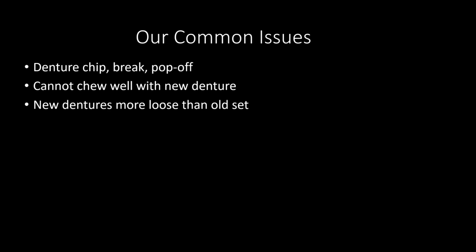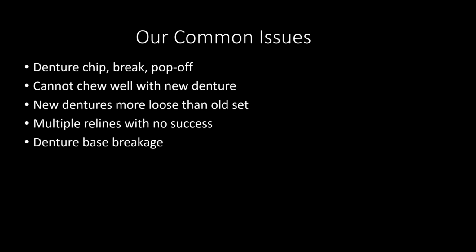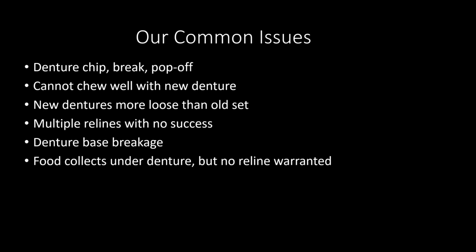The new dentures are more loose than the old set, multiple relines, and it's still not working, and the case still keeps coming back. Denture base fractures, that's always fun within the first 3 months. Food collects under the denture, but no reline warranted.